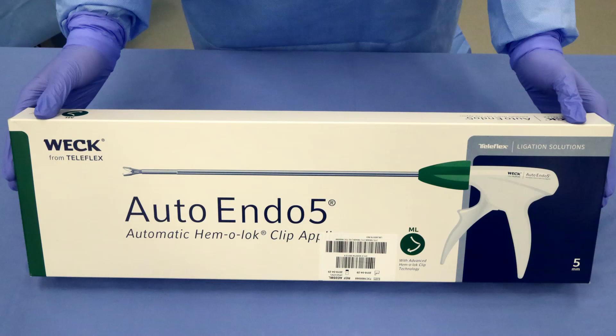The Weck Auto Endo 5 Automatic Hemolock Clip Applier, providing greater confidence in ligation with the efficiency of an automatic platform.